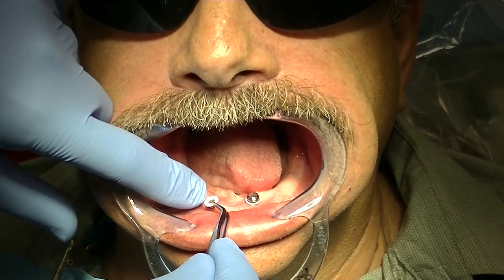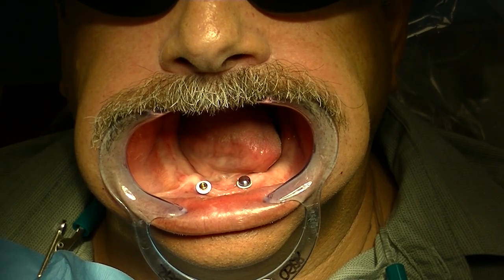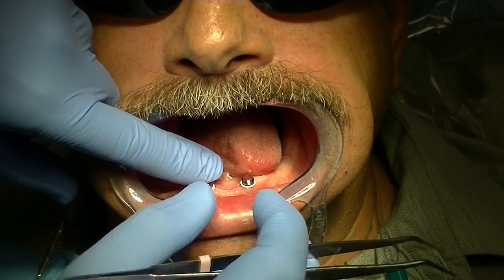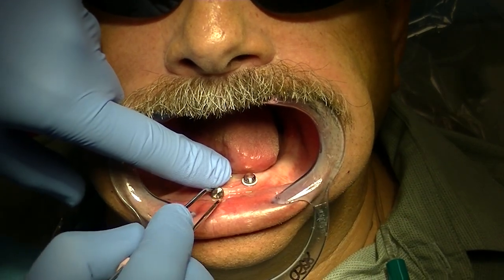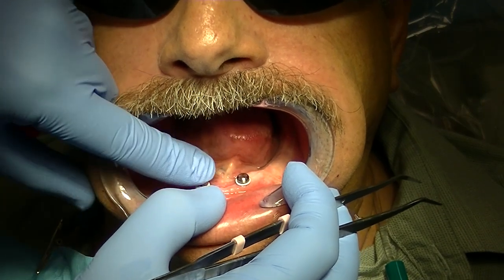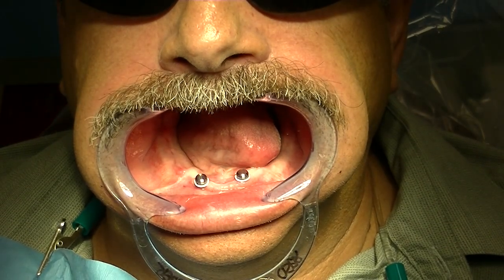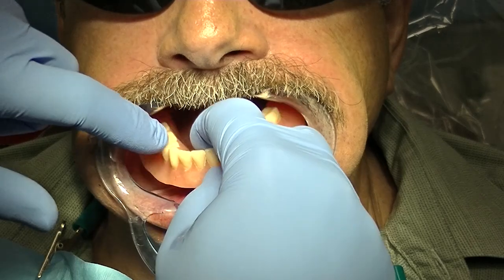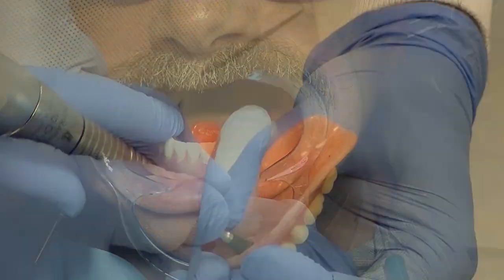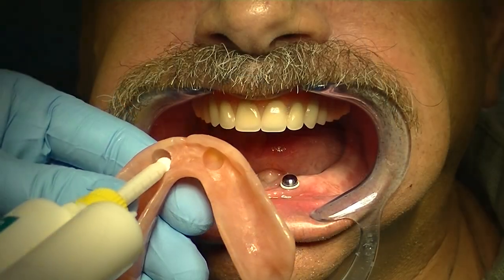Once we verify that we have adequate clearance in the intaglio surface of my complete denture, I'm going to add the second block out spacer and the locator denture cap. I like to insert at an angle rather than straight up and down — I find it easier to insert the denture cap when you come at it at an angle. Just verifying that the denture is passive and I'm not binding anywhere when the denture is in place. You might have a little bit of binding when it goes up and down; however, that is normal as long as you don't have the binding effect when the denture is in place.